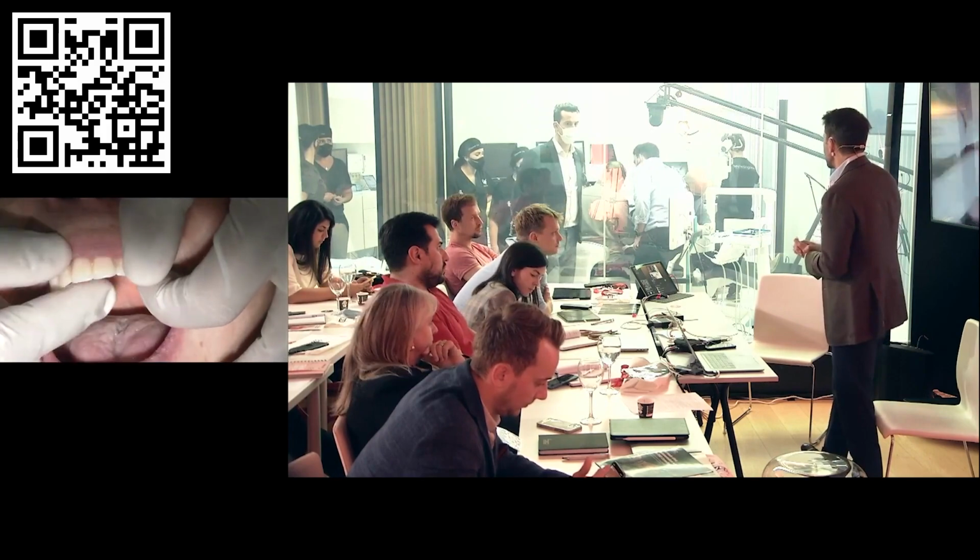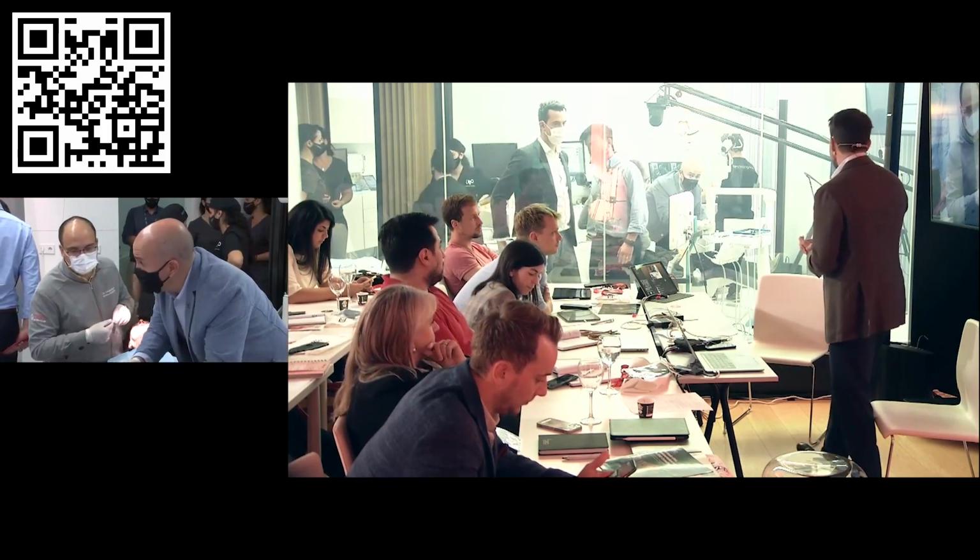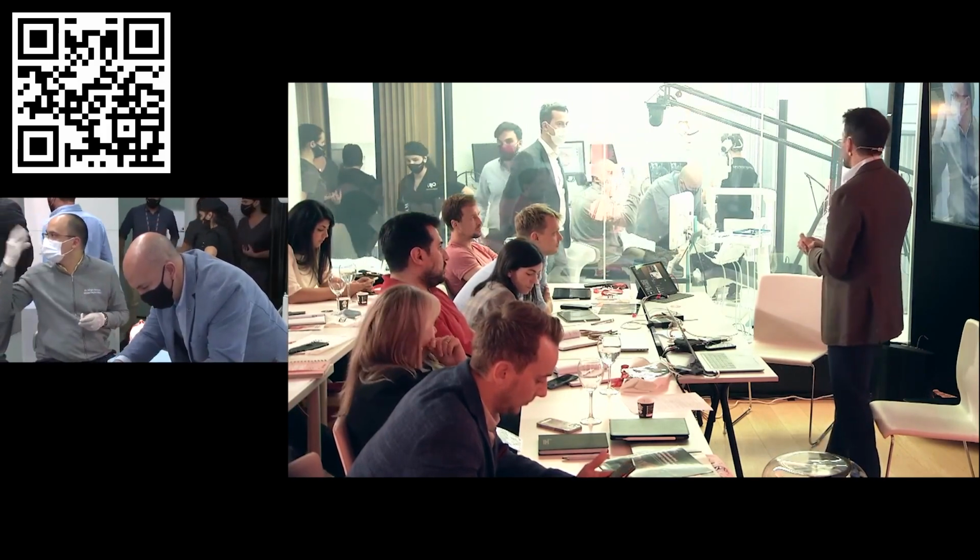This is the zirconia. So this is the final prosthesis. The final prosthesis is the zirconia.